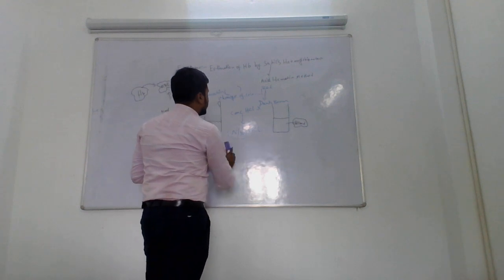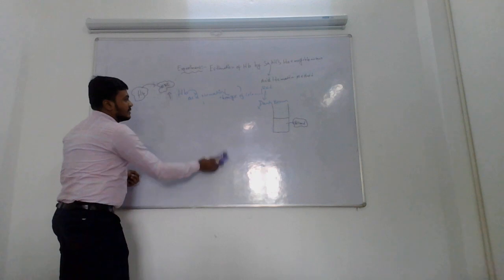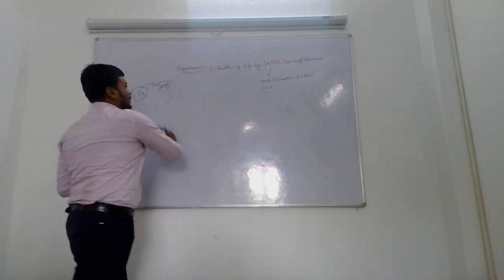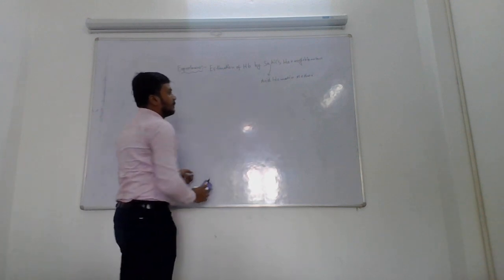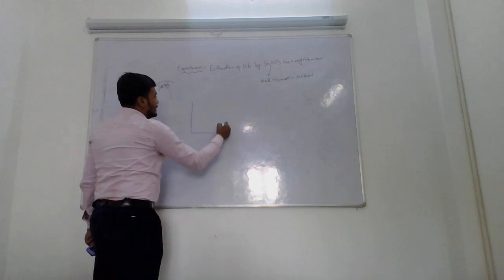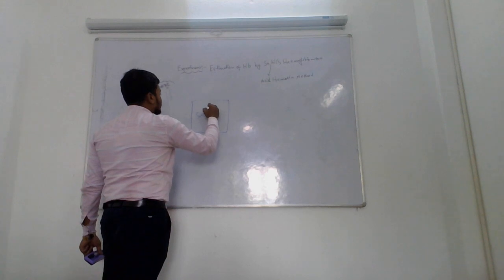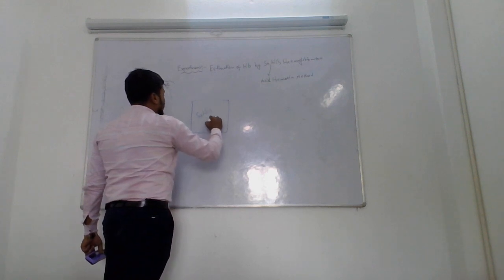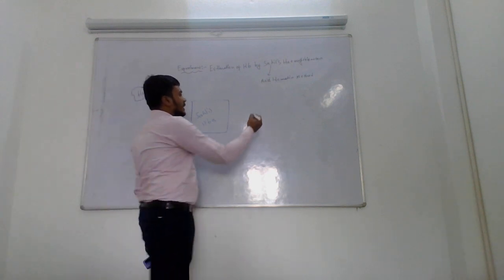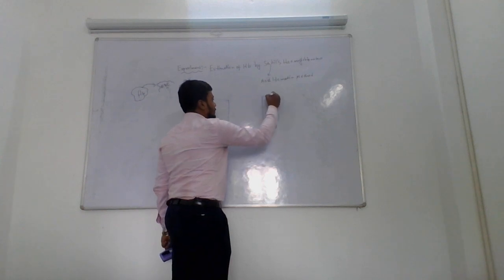Now, considering the several parts of this instrument, we have different components. For this purpose, we have a kit known as Sahli's hemoglobinometer. In that kit, we have several components, like one comparator box.